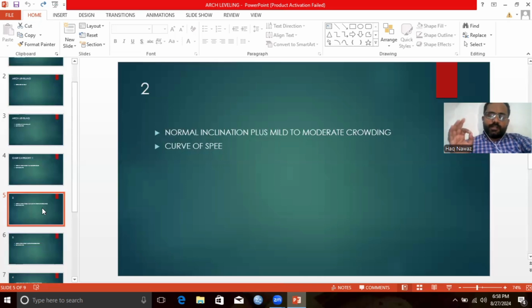When should this IPR be done? We recommend that you do it in a gradual fashion. You start with 0.012 wire, do a little IPR. You move to a higher wire, 0.016 NiTi, 0.018 wire, do a second round of IPR. We recommend you to do IPR in progressive fashion in multiple rounds, not in a single bulk removal. Do it in multiple rounds, giving time for the tooth pulp to adapt to the IPR stress.